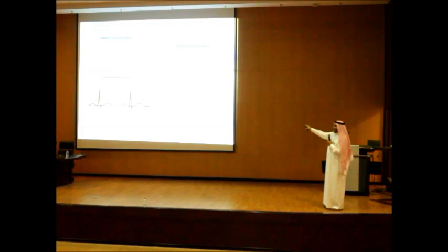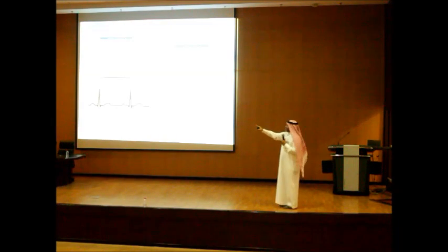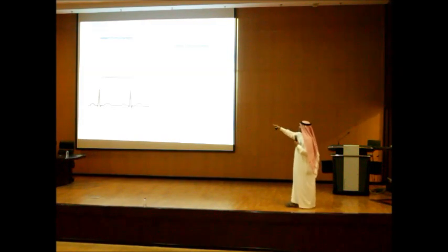So 5 by 5, 25. So this is 1,500 divided by the number of small squares. Simply, if you are really that crazy, you measure how many small squares, you divide 1,500 by that, and it gives you the heart rate of the patient. Nobody does this. It's easier to calculate the large squares.